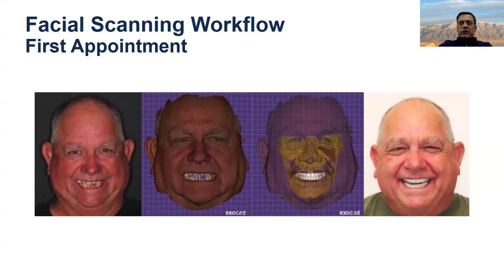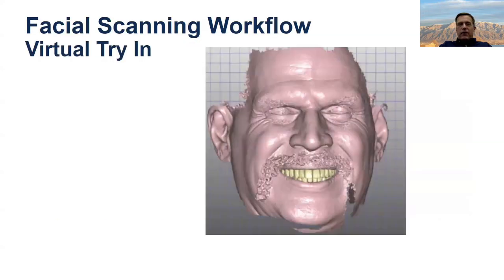And I've seen a bunch of these cases delivered. I've seen 4 or 5 delivered. It's kind of funny because you have the computer screen next to the patient. You turn the image on the screen so that it's looking at you the same way the patient is, and it looks exactly the same. It's really cool. I think this will be the thing. At some point, we're going to be doing all our cases, designing the face, and we'll be like, why did we ever do this any other way? So be looking for opportunities, I'd say, to do this.